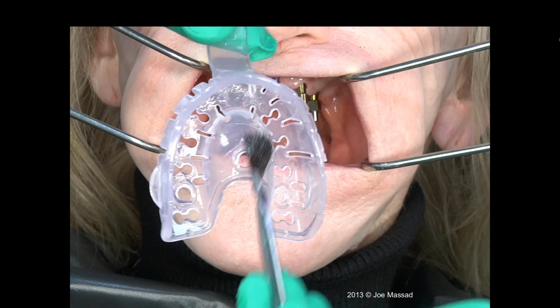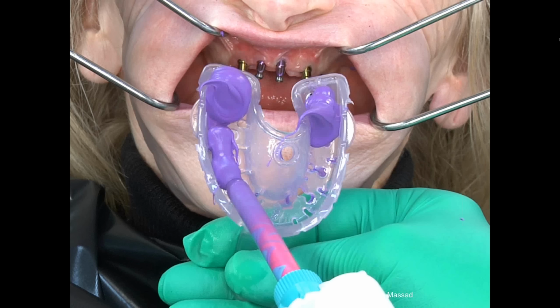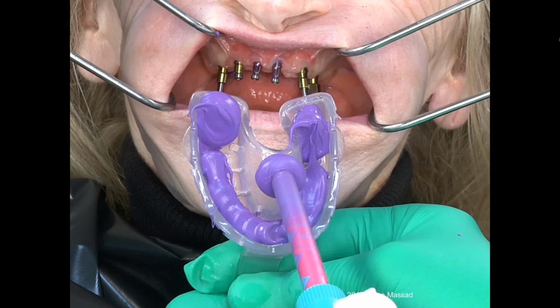So we're going to now inject, if you'll notice, more material where there's edentulous in the back, on the tops of the ridges, and then a smaller amount where I'm going to actually be opposite the implants, and then some on the palatal area. Now, if you'll take a look, this is going to be placed into the mouth and let set. So when I remove it, I will have no rotational movement, anterior or posterior. I want to direct my second time going into the mouth to where it has a single path of insertion and there'll be no rotational movements.